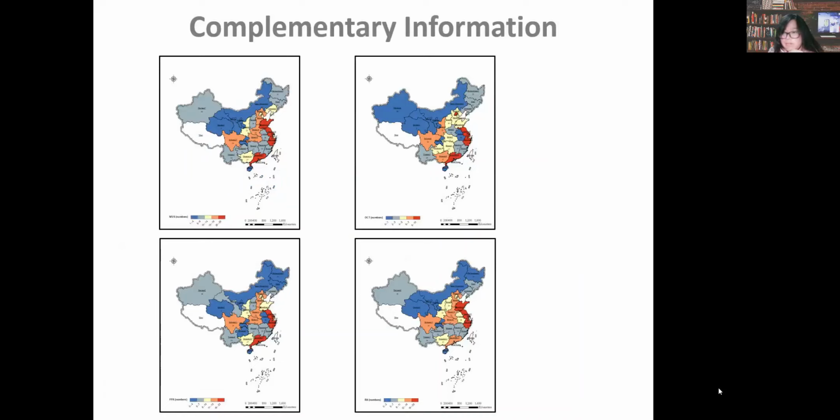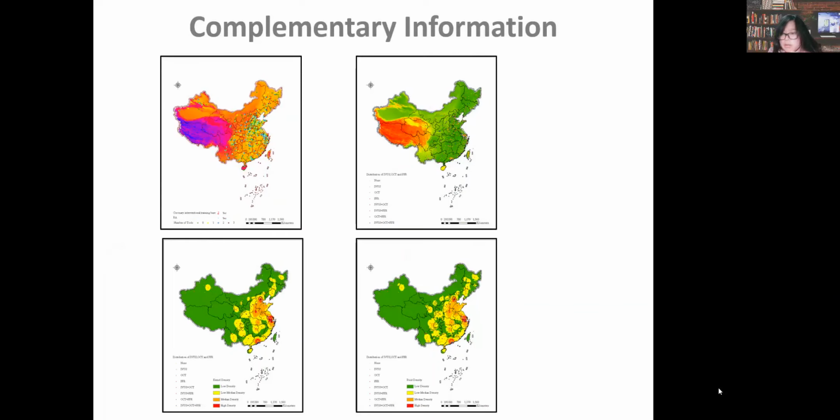Apart from this paper, in my spare time, I looked up the information about the number of tools on the official website. After analysis, the distribution of coronary intravascular imaging and physiological function in China, to some extent, told us that not every hospital used all types. Present intracoronary technical characteristics and clinical application have a lot to be learned.